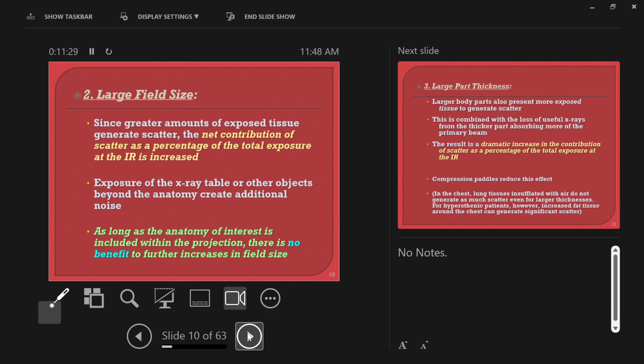I have had that happen where it went out in the office. It's like, we need to keep taking X-rays, and you're guessing, and you definitely should not be doing that. Right? It's just not a good way to do it. So I would advise you to make sure that your office has backup light bulbs for their collimator, unless they've got a service guy that can get out there that day, or they're just okay with having their X-ray room go down until a service person can get out. It's really important to have backup light bulbs.